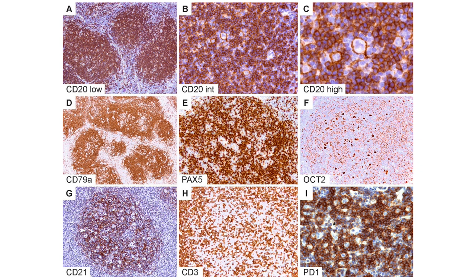Returning to immunophenotyping of nodular lymphocyte predominant Hodgkin lymphoma: in figure A, CD20 highlights numerous classic lymphoid nodules. Figures B and C show scattered LP cells residing within the nodules, containing a microenvironment rich in small B lymphocytes. Figure D shows CD79A, and figure E shows PAX-5. OCT2 is another B cell marker expressed in NLPHL with bright nuclear staining, similar to BOB1. Both OCT2 and BOB1 are positive.